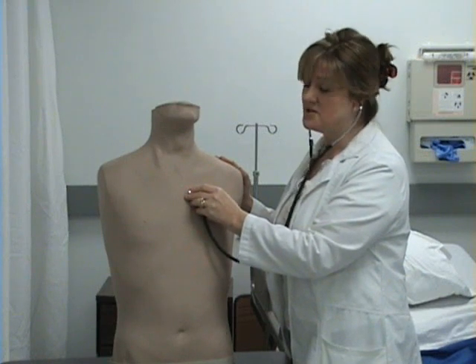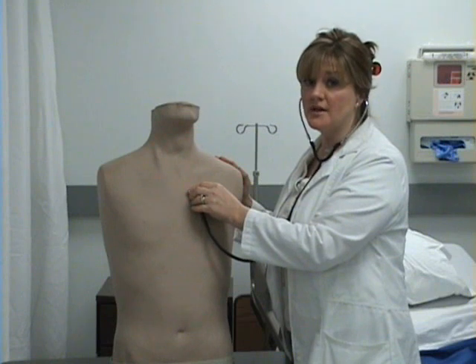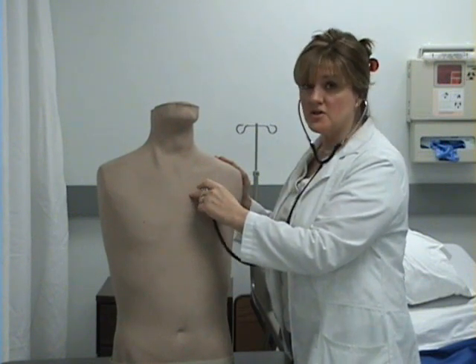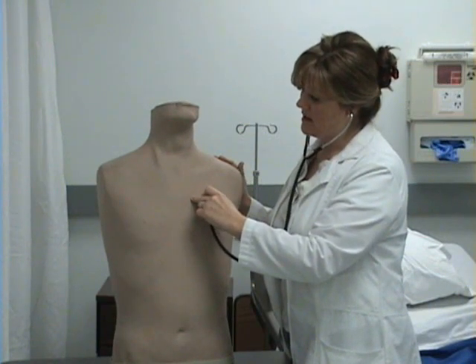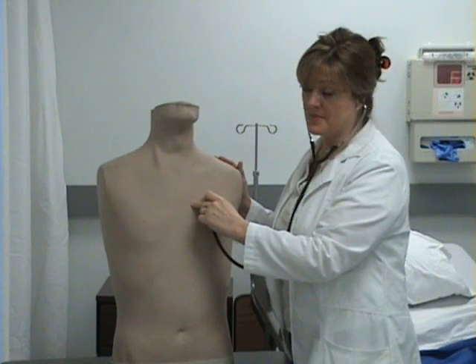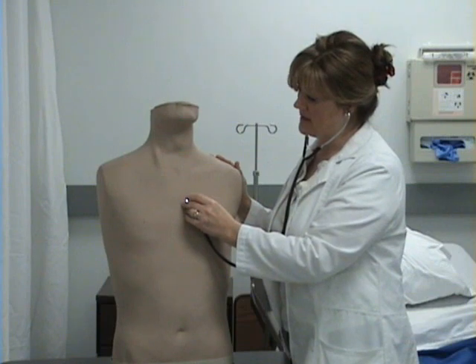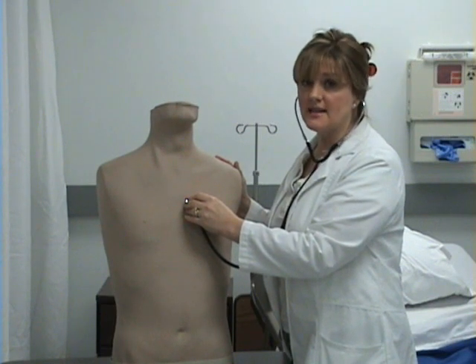I'll listen. This is Erb's point. At Erb's point, S1 and S2 are equal. Murmurs are especially audible at Erb's point. Next, I'll move down. I feel a rib. I move down to the fourth intercostal space, left sternal border, and I'll auscultate. This is the tricuspid valve. S1 is louder than S2.